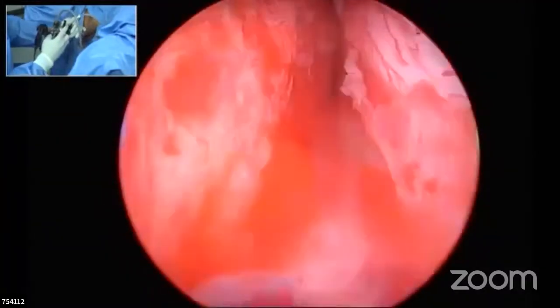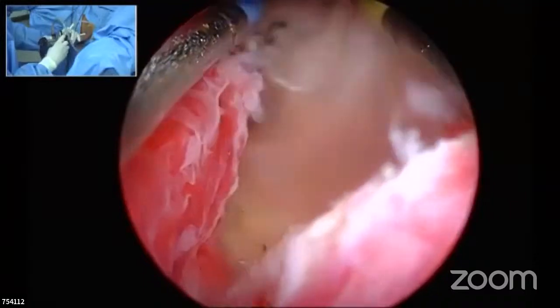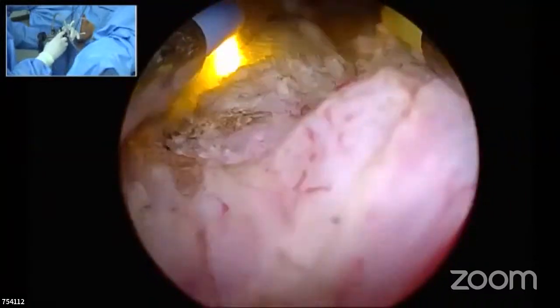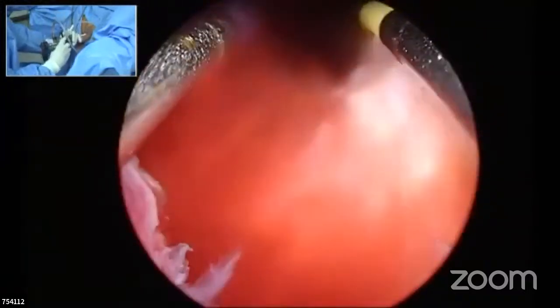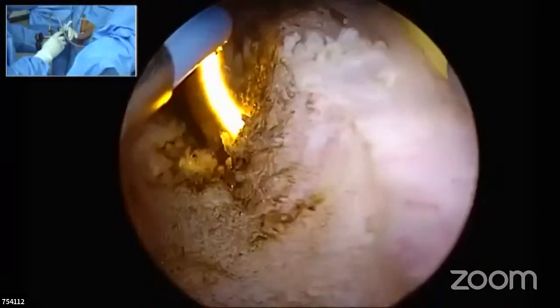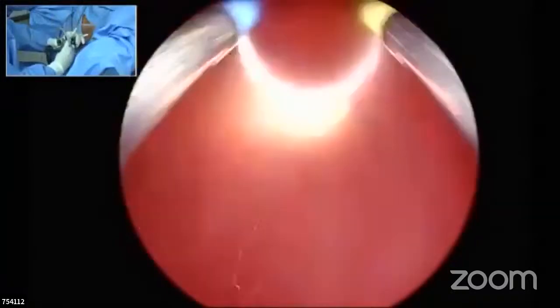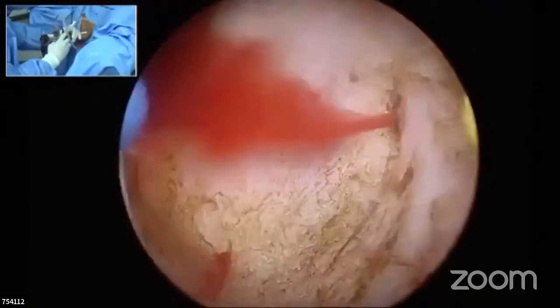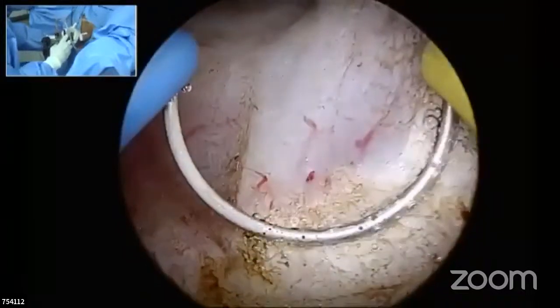say, if this is the verumontanum, I'm keeping it here. I'll start my loop there. I start resecting there. I come out and come up to this point. And I move my resectoscope behind. From here, I'll move my resectoscope behind and my left hand is moving the resectoscope away. So that is an extended length cut wherein you will get a more than 2 centimeter or 2.5 centimeter chip size. But I don't think that is a routine thing.